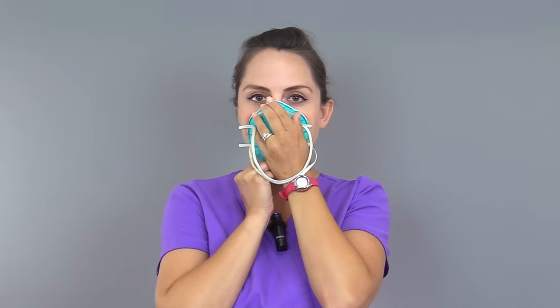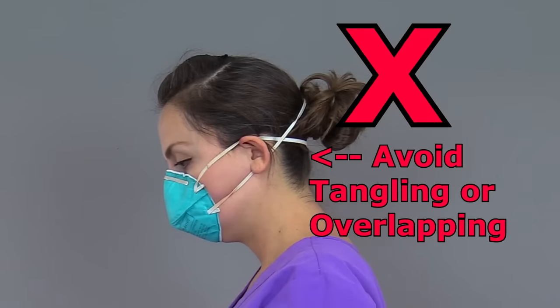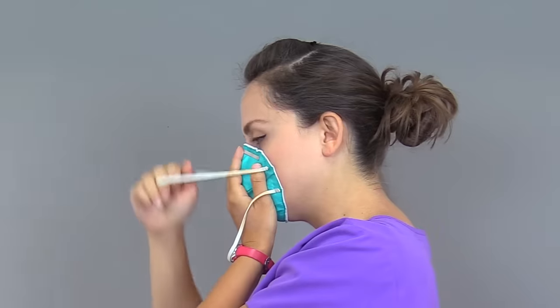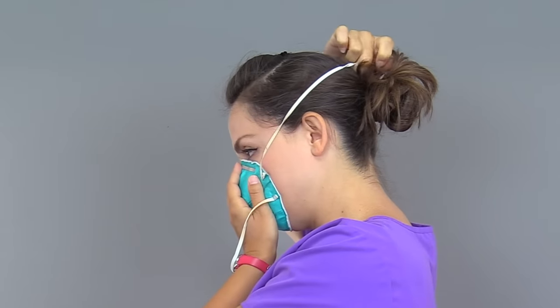Take the respirator and place it over your nose, mouth, and under the chin. Hold the respirator in place with one hand. Use your free hand to place the straps on your head. It's very important the straps rest on the head and that they are not overlapping or tangled. Take the top strap of the respirator and place it just past the top of your head, above the ears.